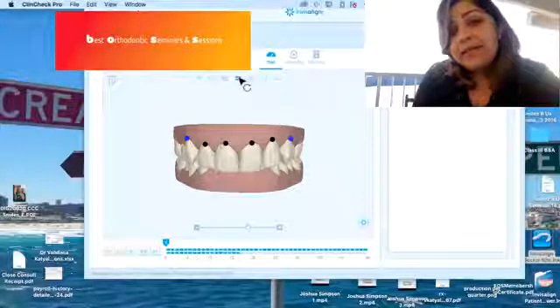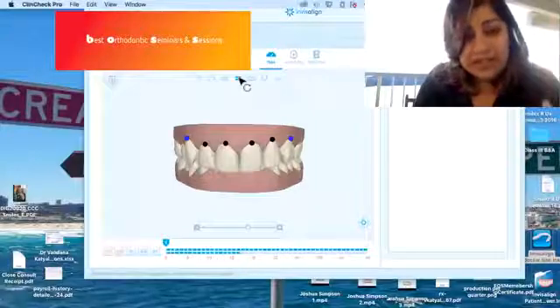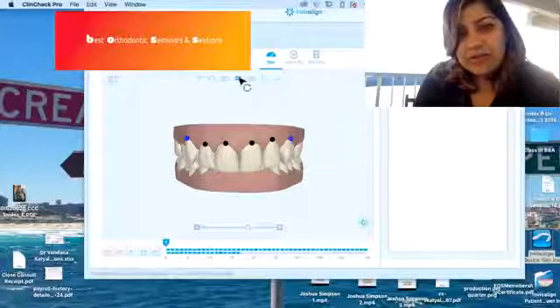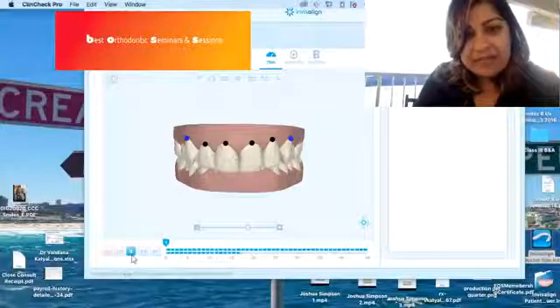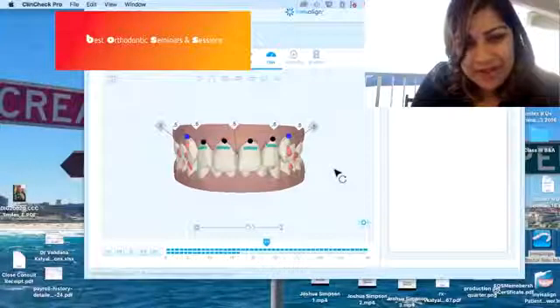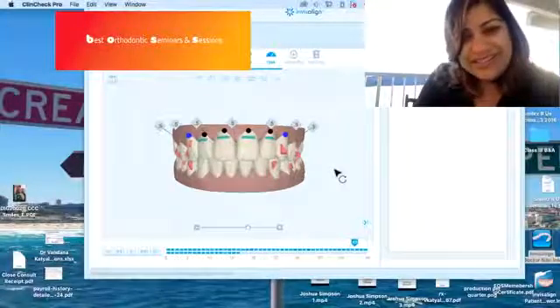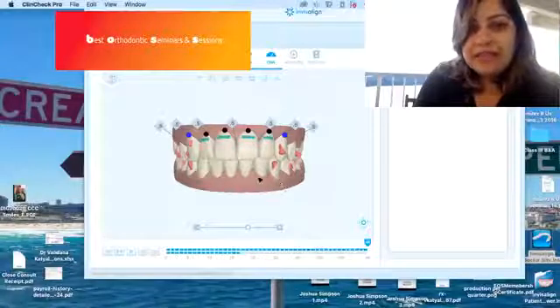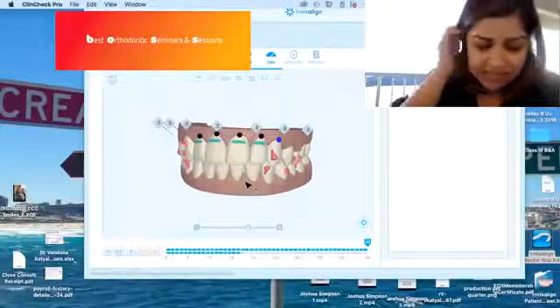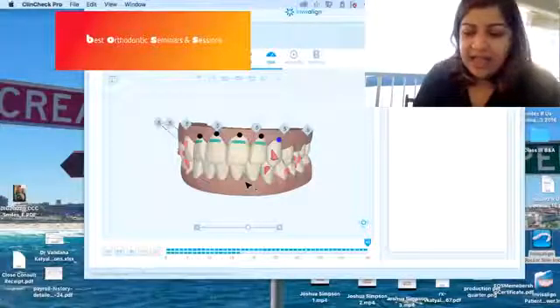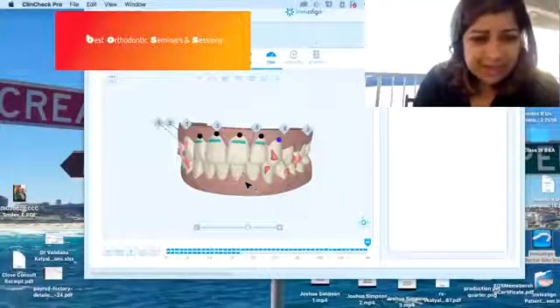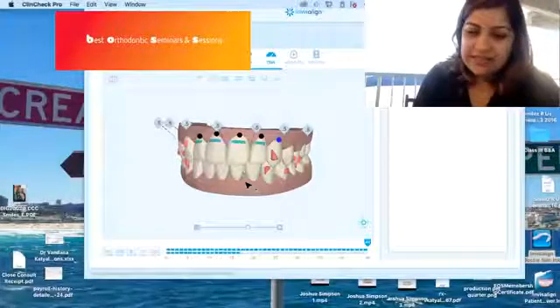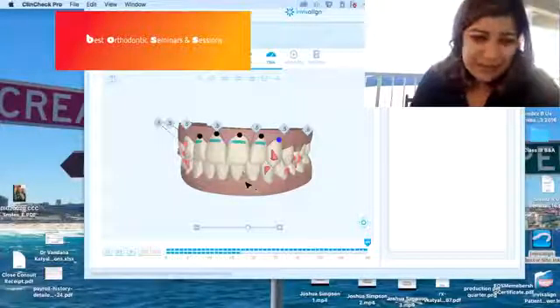Yes, guys, this is my little hot tip for Class 2 Deep Bite Young Adult with Invisalign. There's other things, really, with this ClinCheck, and they're minor. But the whole thing was about how do we open Deep Bite, how do we correct the Class 2. And this one actually had, if you see here, IPR planned as well. And that's really excessive IPR as well. 0.5 millimeter just to reduce the overjet when you can distalize a little bit. And you can derotate and expand and create space. So I think it was an overkill when this ClinCheck, from what I understand, this dentist did approach the clinical advisory service of the partner accreditation company. And they still thought that this was a good setup. And I really think this is quite a bad setup. So it will not give you the result that you want. And I'm glad that I was able to help here. And hopefully you guys learned something from me sharing this with you today.